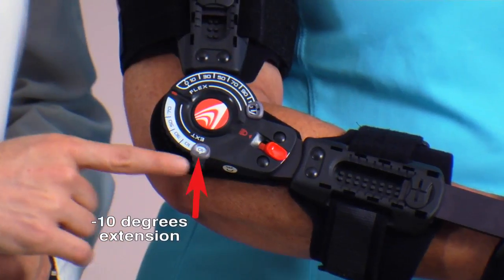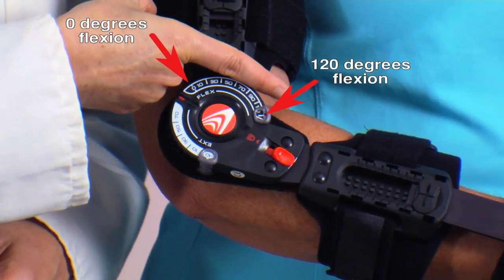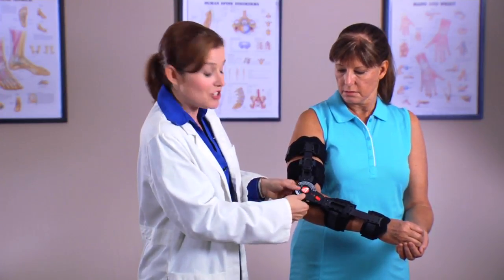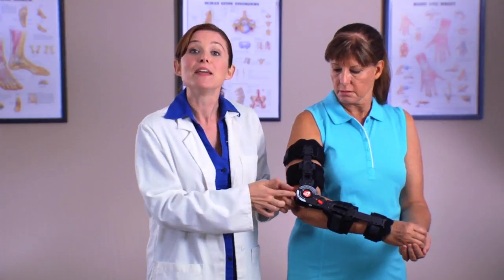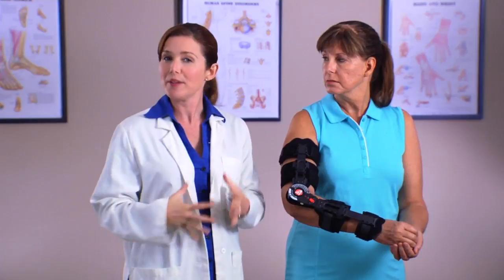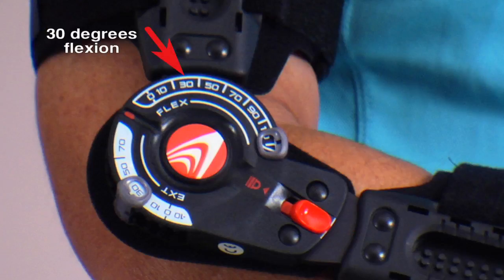Extension settings can be set between negative 10 degrees (hyperextension) and 120 degrees, while the flexion settings can be set to 0 degrees and 120 degrees. To adjust the extension settings, pull the tab out away from the center of the hinge and slide it to the desired settings. Make sure the tab is secured in the correct position. Similar to a speedometer, there's a combination of numbers and tick marks that represent the extension and flexion settings on the hinge. For example, here is 30 degrees flexion and here is 40 degrees flexion.